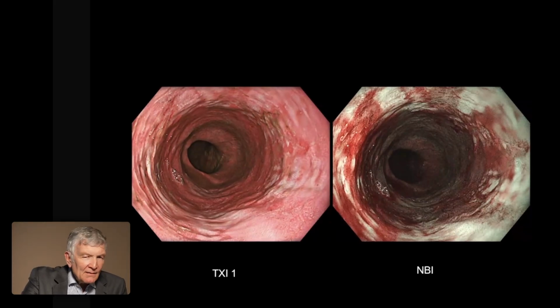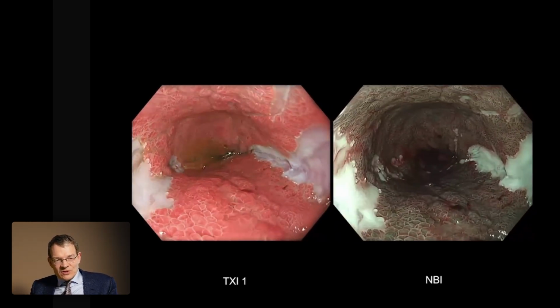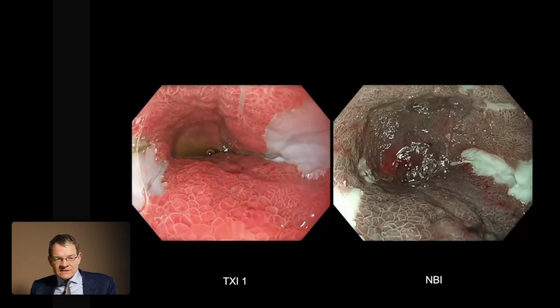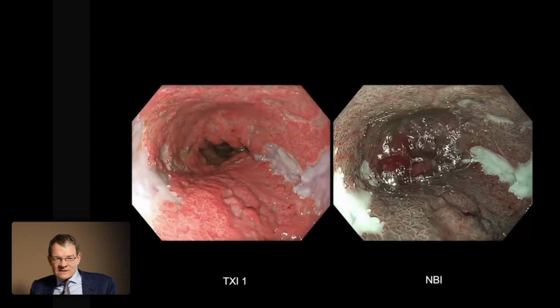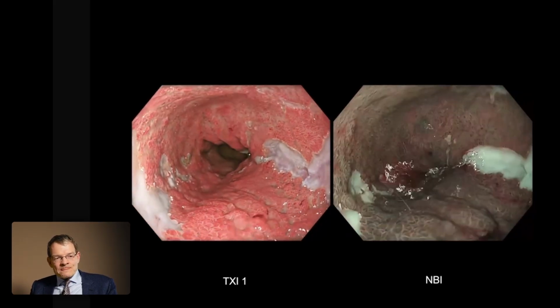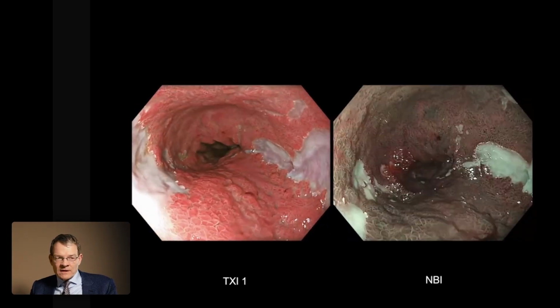I agree. Right side, nice picture, but you see nothing. Yes, definitely. Another example here, also a patient with a very special Barrett's with large glands. And here we have the same problem when we are using NBI. The bile reflux is really disturbing our image. And here with TXI, we have a brighter and sharper image. My impression is that TXI is quite helpful in the endoscopic assessment of Barrett's esophagus.